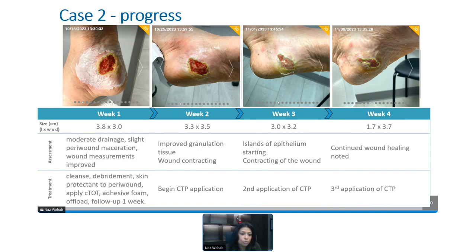The wound is becoming a lot less fibrotic. It's becoming softer, easier to debride, more exudative. Because of that exudate, we actually had to protect that peri-wound with the barrier cream, and that's why you see that there. But you can imagine that we're moving this from that chronic inflammatory stage to the proliferative stage, and we're getting cellular movement there, and that is why this is happening. Those are all good things that are occurring.